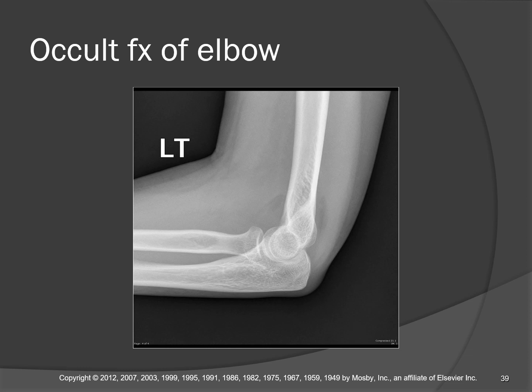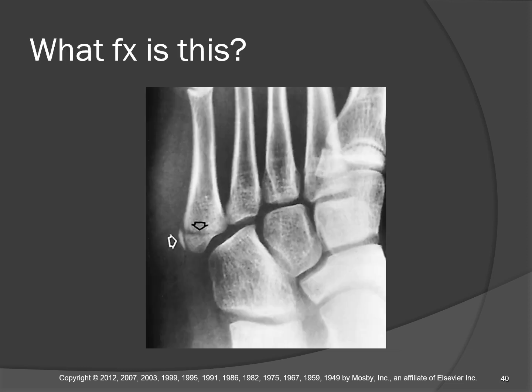I don't see the fracture myself. Typically, your fractures here with the occult sign is either radial head fracture or possibly distal humerus fracture. Okay. But those fat pads are pushed out of the fossas by pooling hematomas. And we went through that in Rad Procedures 1.